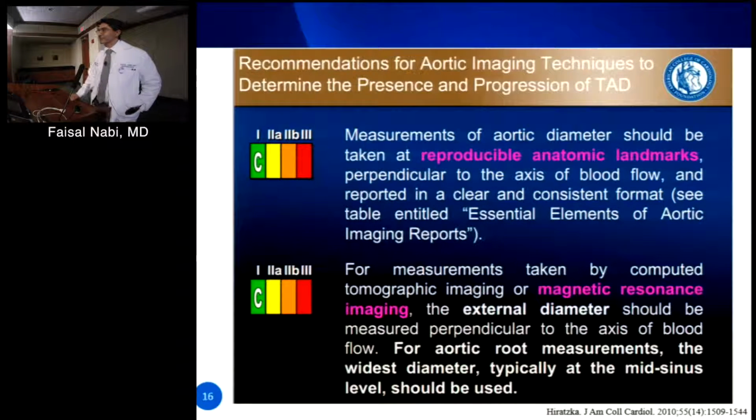You'd like to see a CT or an MRI to truly look at the 3D dimension and that outside world. But this is the issue with ultrasound. If you see them well, I would measure outside to outside. But most of the time, you may not, and then you don't know where that number is. Yeah, it's interesting. It's sort of amazing.